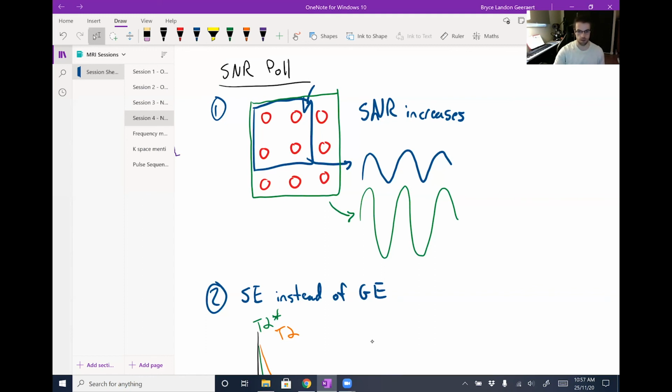I've got another question here. Oh, so the noise in MRI is white additive Gaussian. What is the origin of being white or Gaussian, or both, from the device?